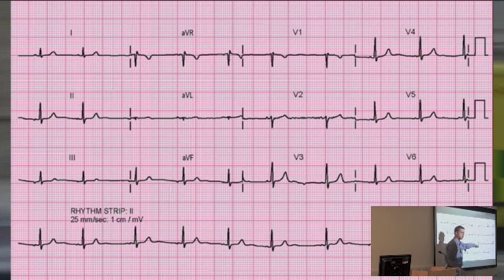And we're going to go right the way across systematically through each lead and see if it's normal. You might spot some obvious patterns. And it's okay then to say the obvious abnormality on this ECG is the patient's in VF or whatever. It's okay to comment on the obvious abnormalities. But you've really got to recognise the characteristic patterns in each lead, like for example AVR, which is completely upside down, and where you'll get T inversion, like V1. So that's a normal ECG.